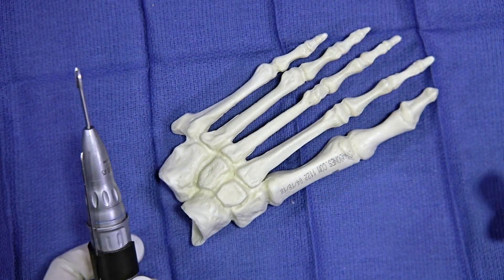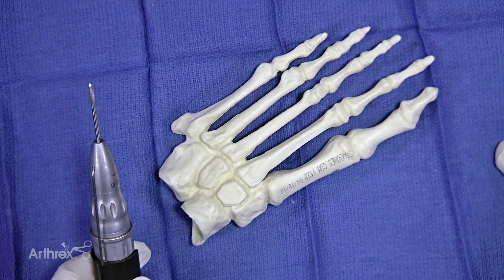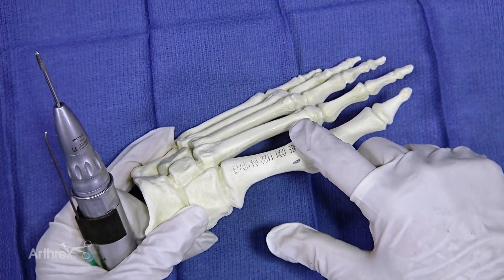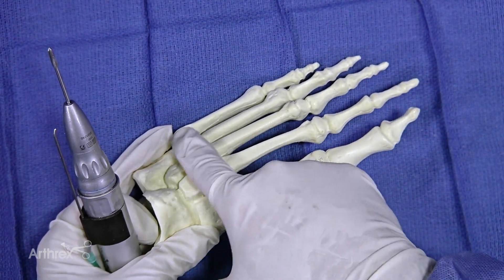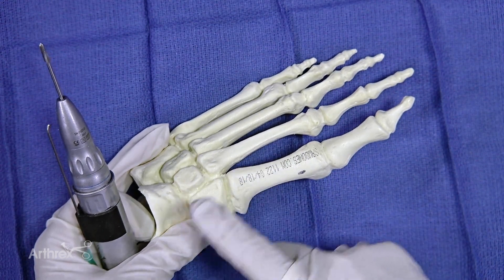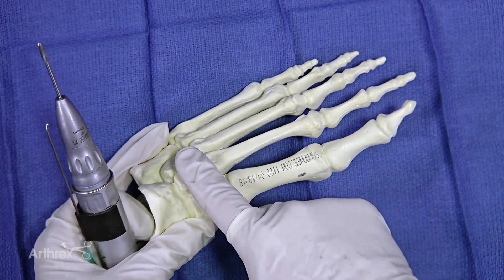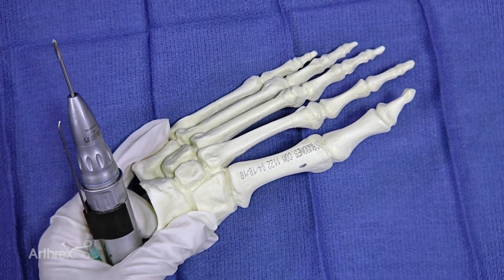We're going to demonstrate the chylectomy. The chylectomy can be done as a standard chylectomy for the hallux. This is also very useful with people with midfoot arthritis or arthritis in other joints, where you can do this minimally invasive and basically shave off the dorsal bossing that some people get sometimes.